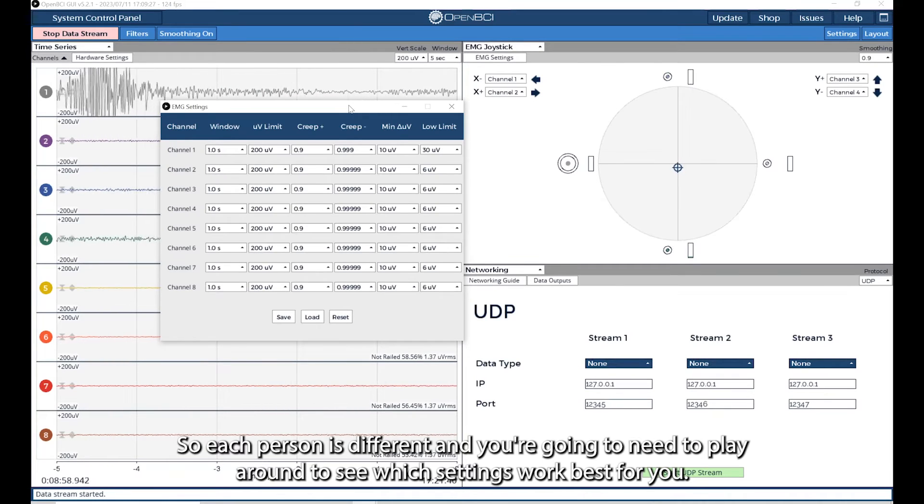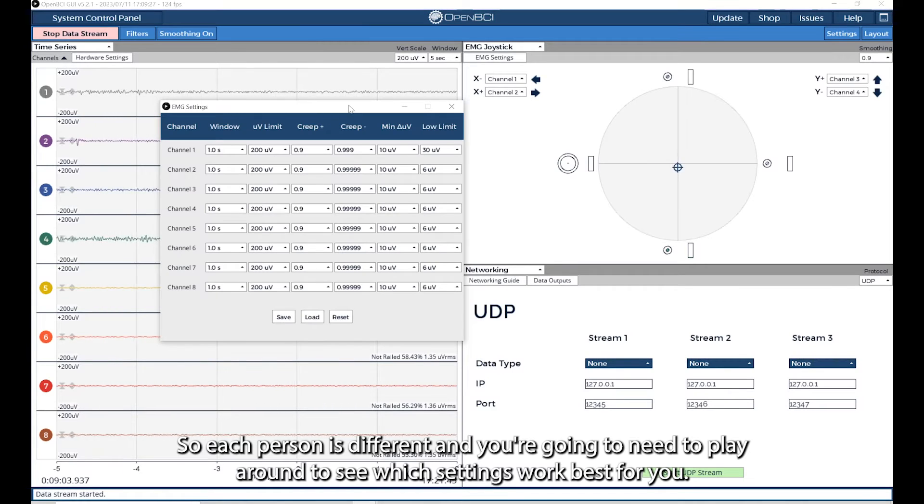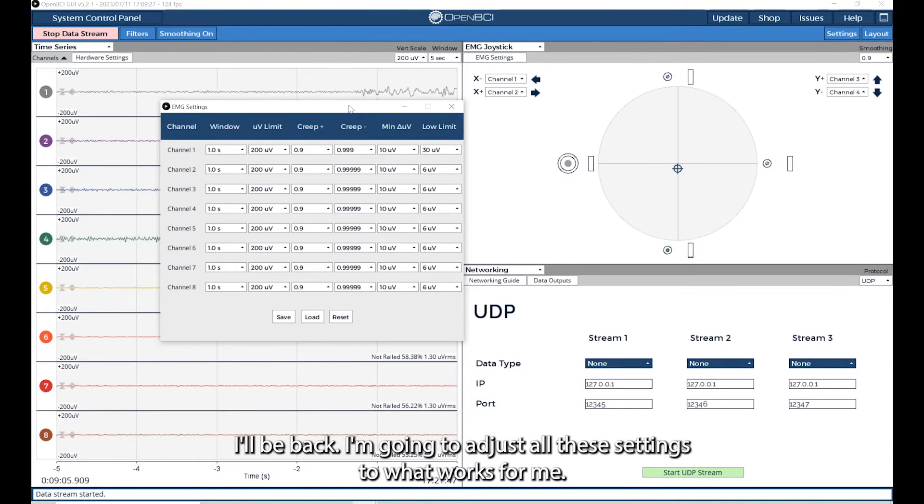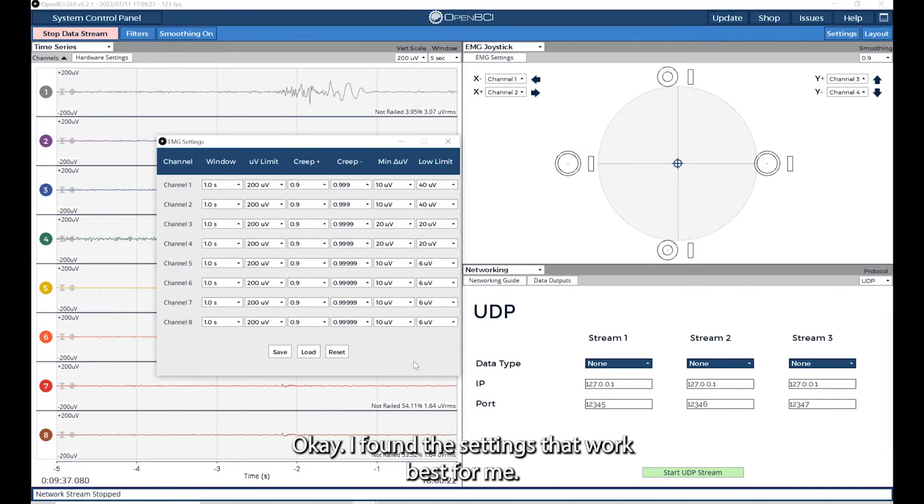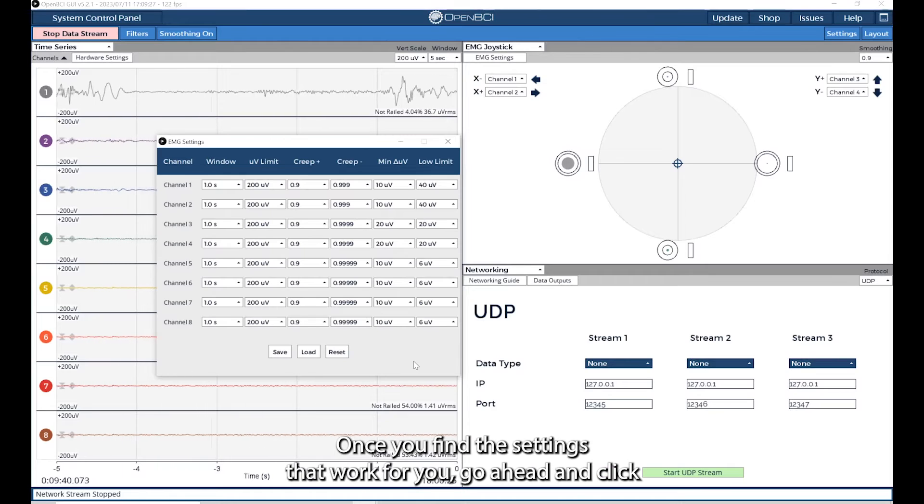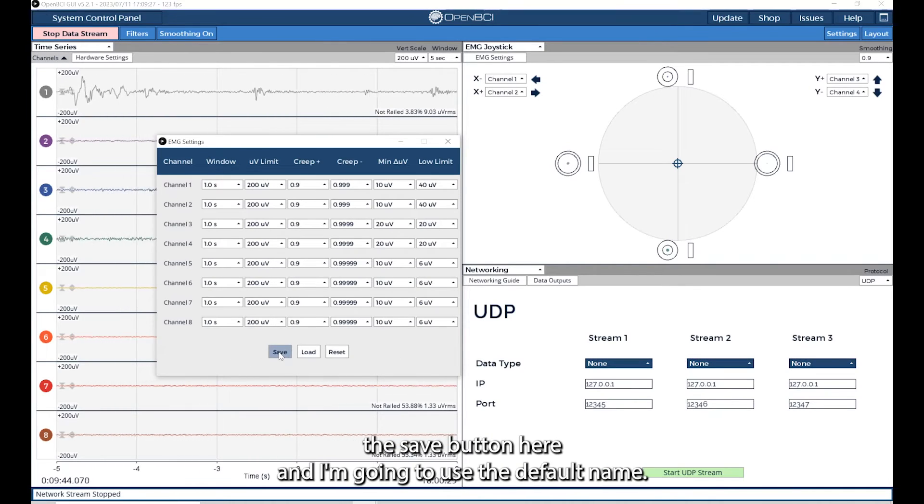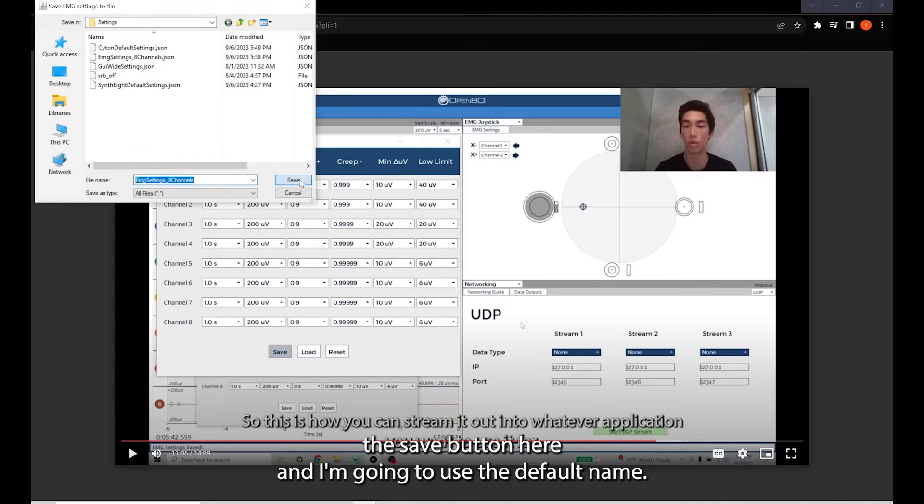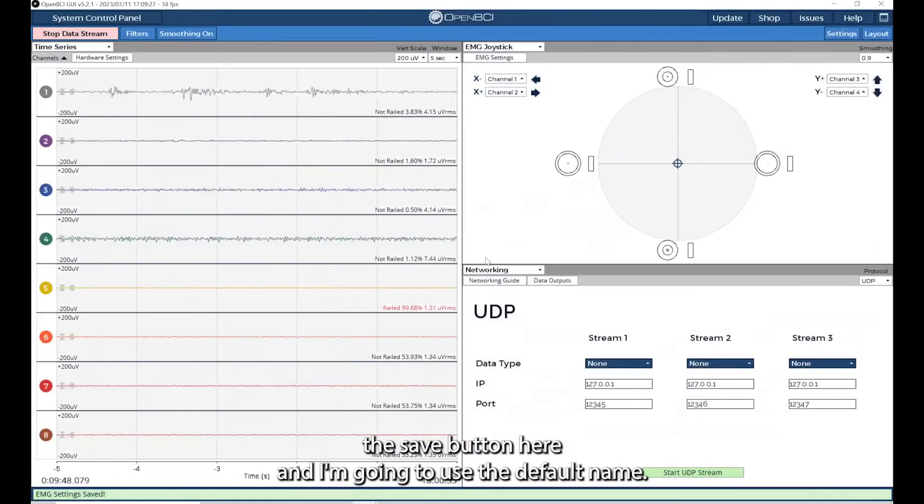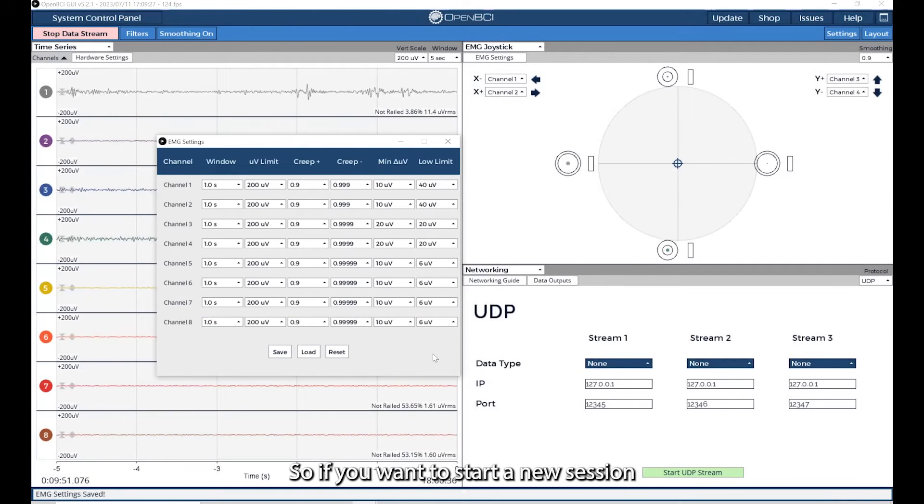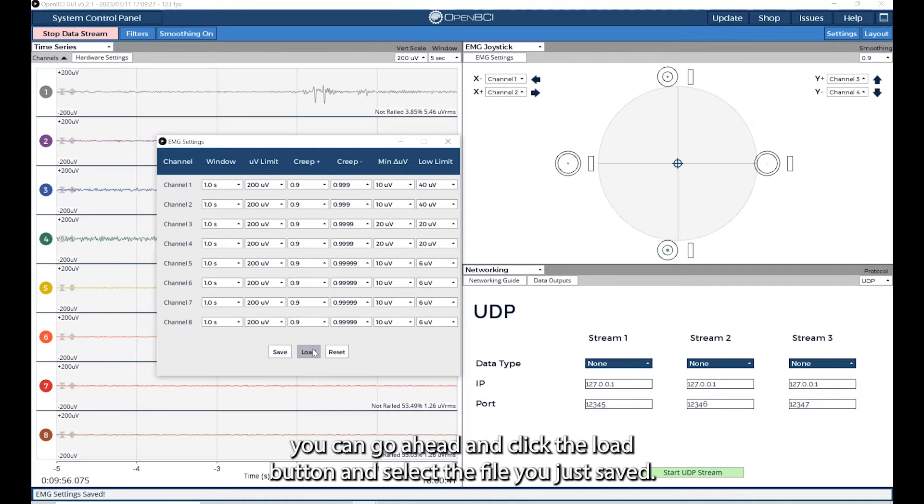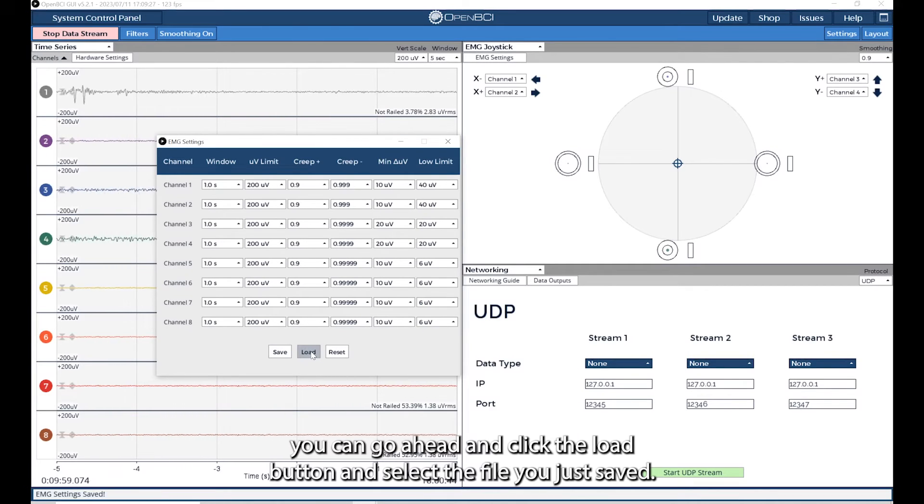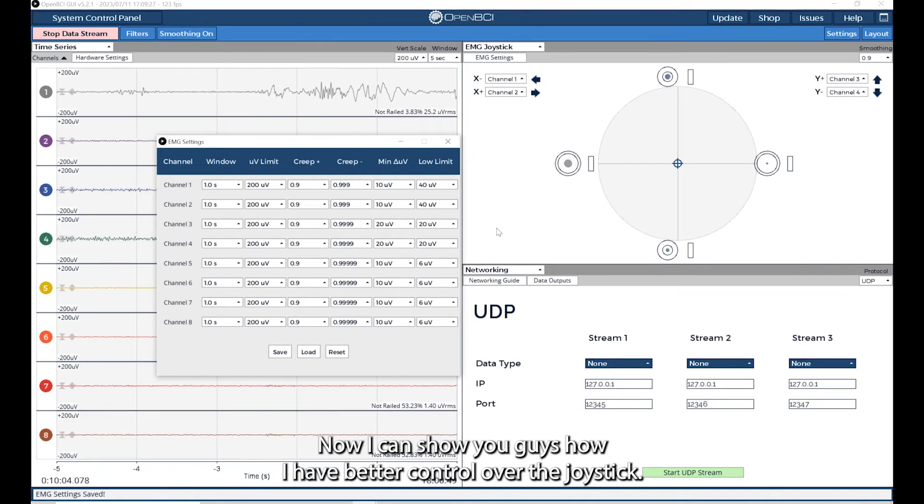I'll be back, I'm going to adjust all these settings to what works for me. I found the settings that work best for me. Once you find the settings that work for you, go ahead and click the Save button here. And I'm going to use the default name. If you want to start a new session and not have to manually input all the parameters again, you can go ahead and click the Load button and select the file you just saved.